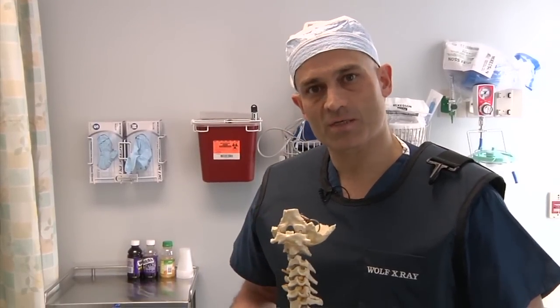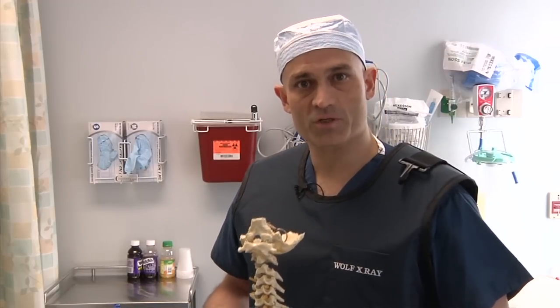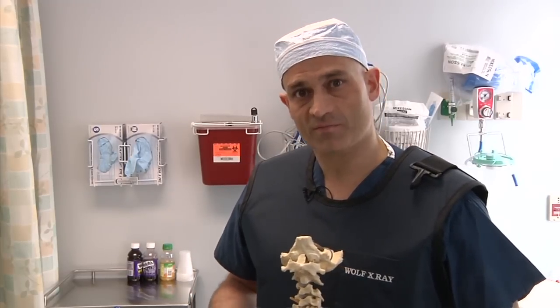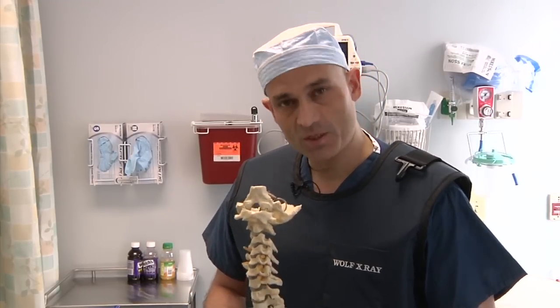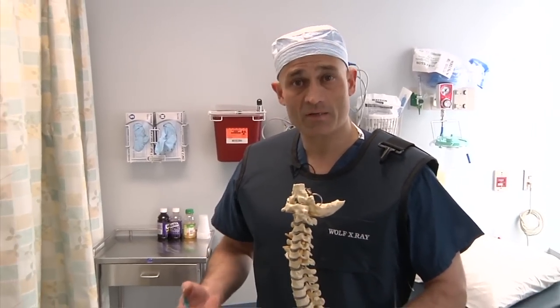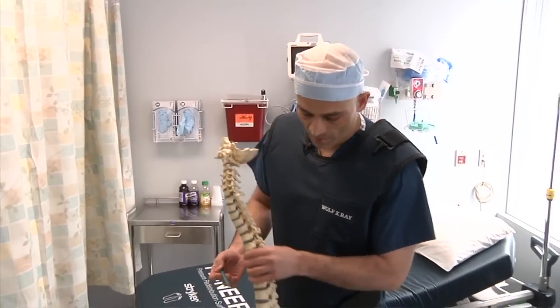Today we're going to demonstrate a lumbar facet steroid injection. This is a procedure that's used for the diagnosis and treatment of lumbar facet pain. And I'm going to use this spinal model to demonstrate some of the anatomical and technical features of the procedure.